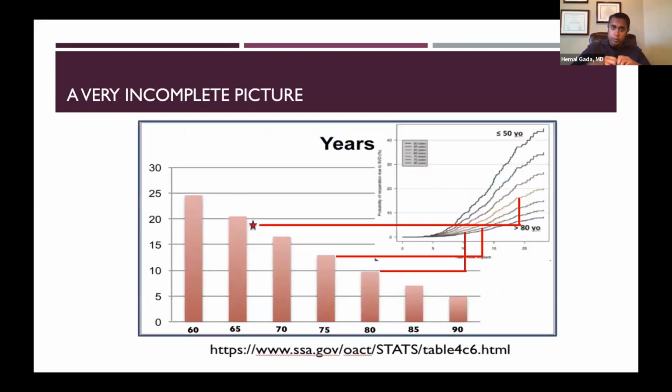However, it is a very incomplete picture because we have not been doing TAVR in the lion's share of patients who are at low risk, who are younger. And what we know from the surgical data is that those patients are the ones that tend to have more limited durability. So more to come, but I think we can at least posit that with the data that we have currently, durability as it relates to a supraannular platform appears to be quite good.